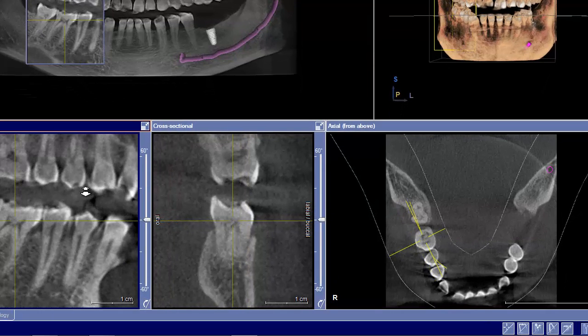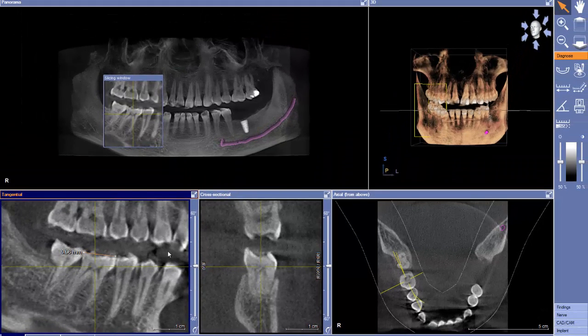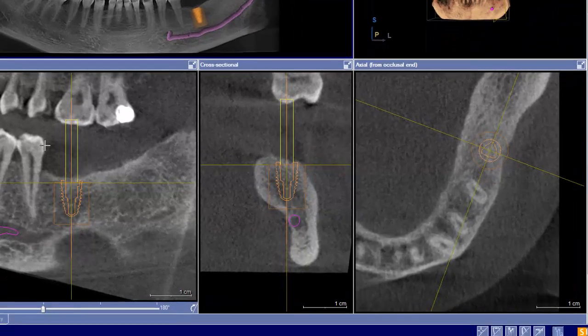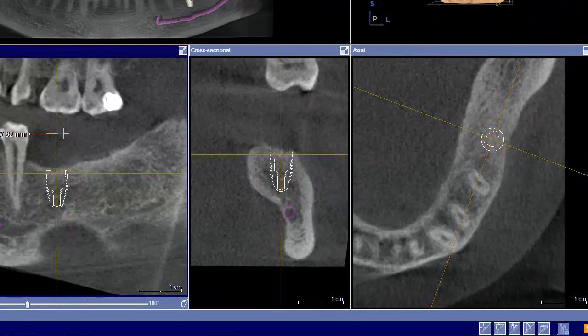What I would like to do is a little bit of a trick here, where I'm going to measure tooth number 30 on the opposite side. And we're going to measure that to be about, say, 10 millimeters wide. That'll mean that in all likelihood, tooth number 19 should be about 10 millimeters wide. So we'll go with that and make that about 10 millimeters wide or so right there.